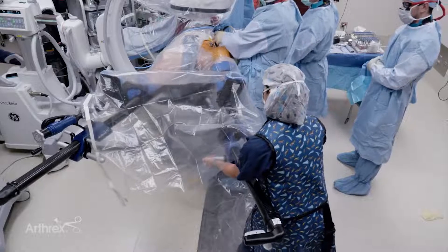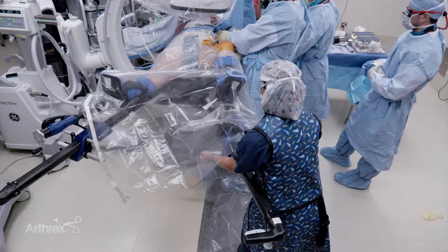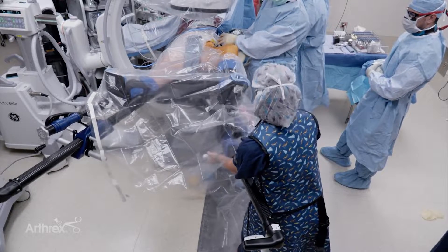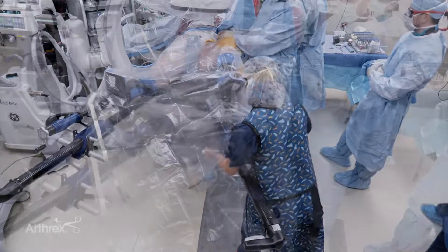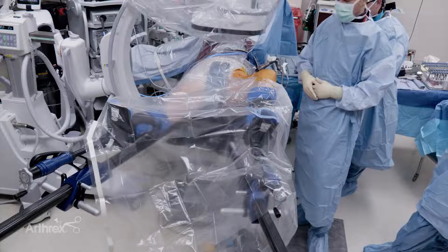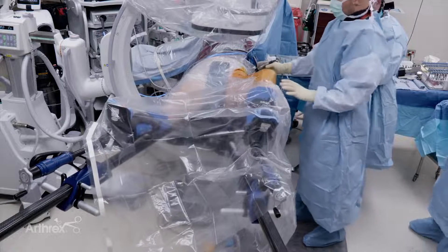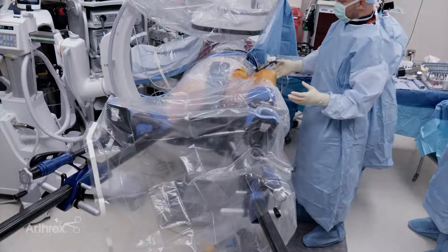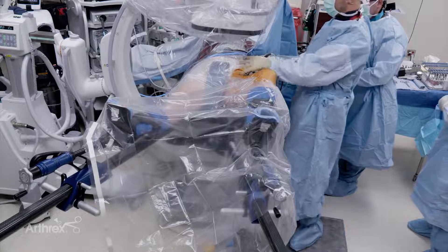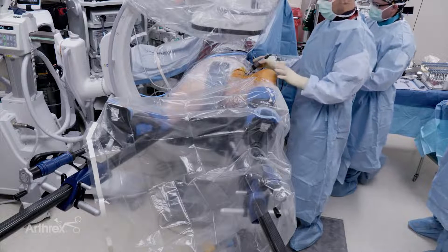To work our femoroplasty, we'll do some bed repositioning. We'll abduct a little bit and flex just a little more. We've finished our labral repair. We're now managing our capsule and going to do our femoroplasty — we don't need to be in traction anymore. For the femoroplasty, I'm viewing from a mid-anterior portal, which gives us nice access to the soft tissues anteriorly.